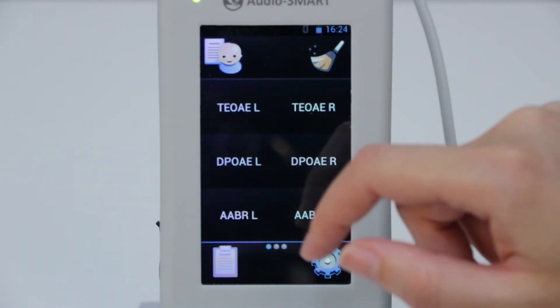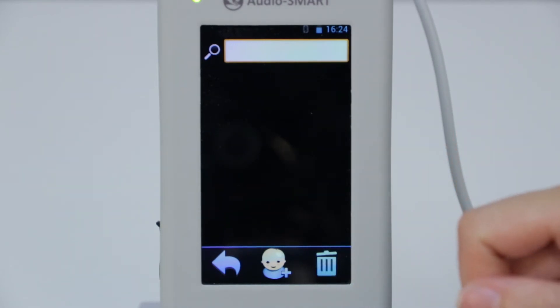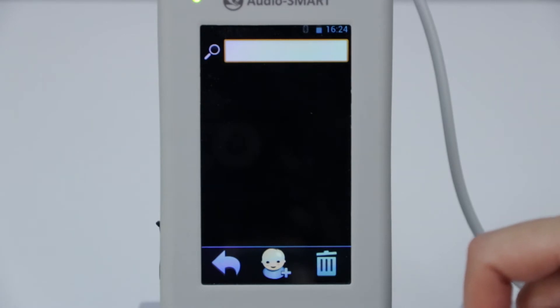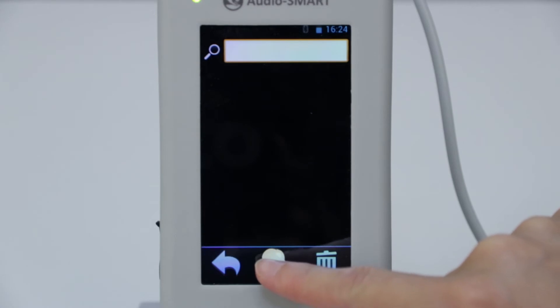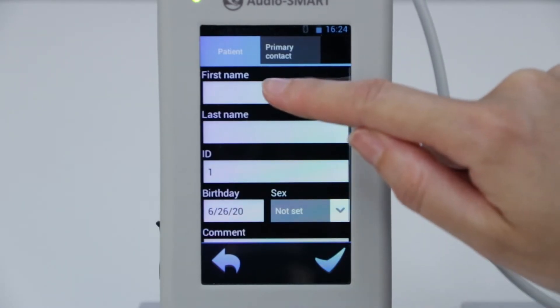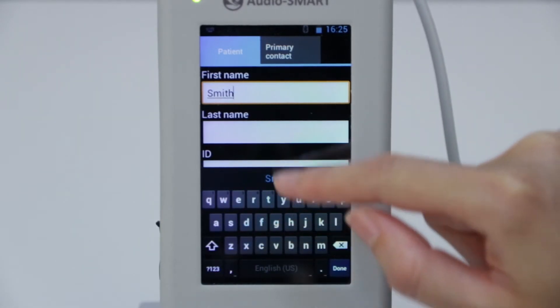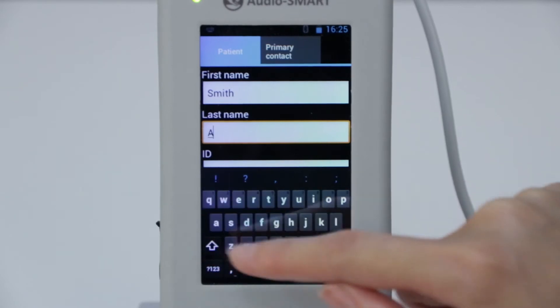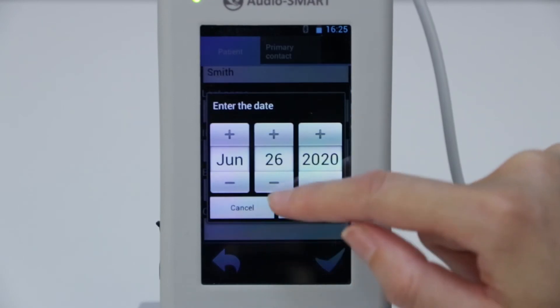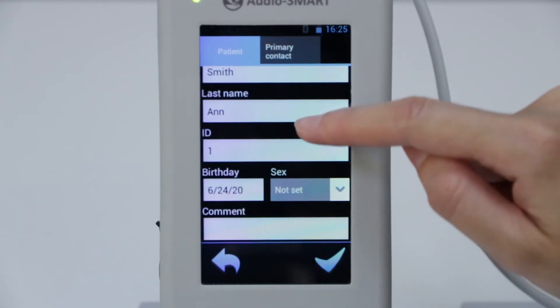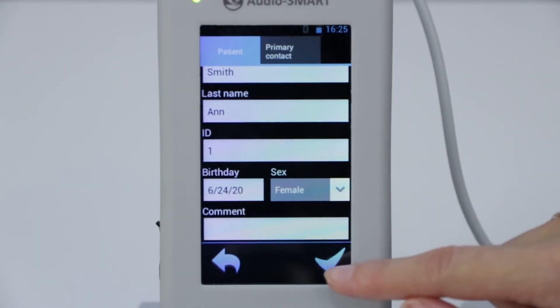Now we need to create a new patient card, or if your patient was diagnosed before, you can choose them from the list. But we have a new patient now, so we need to insert the patient's data.